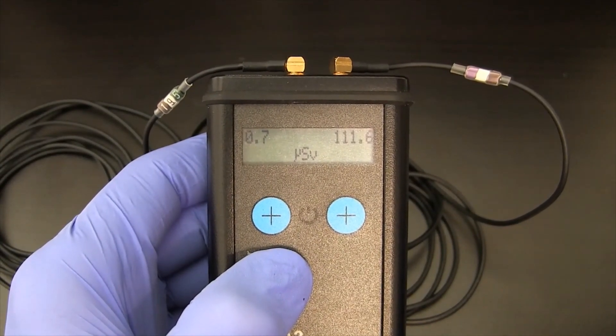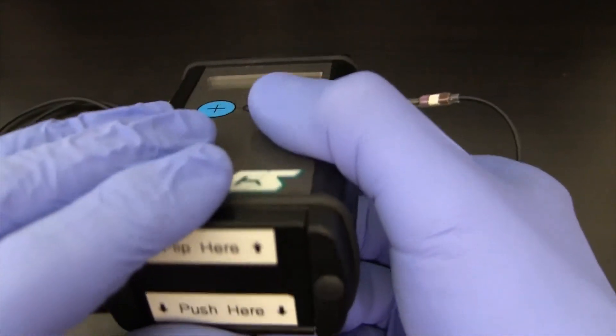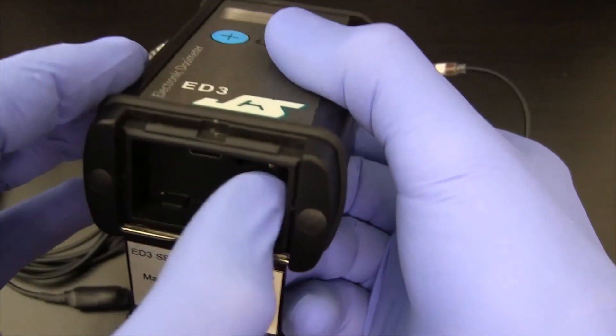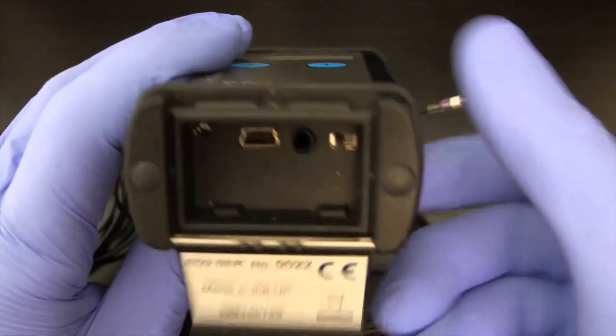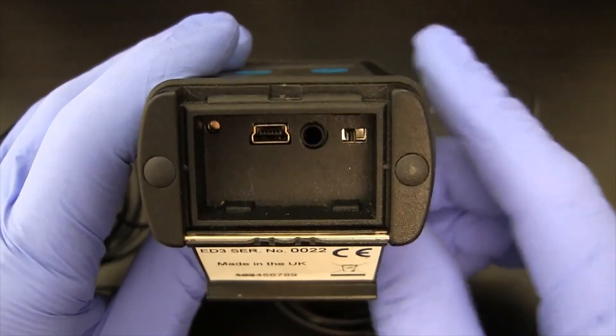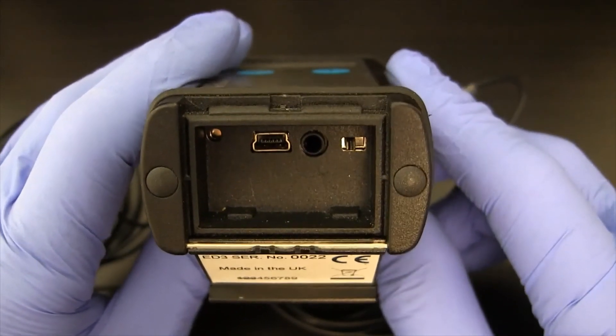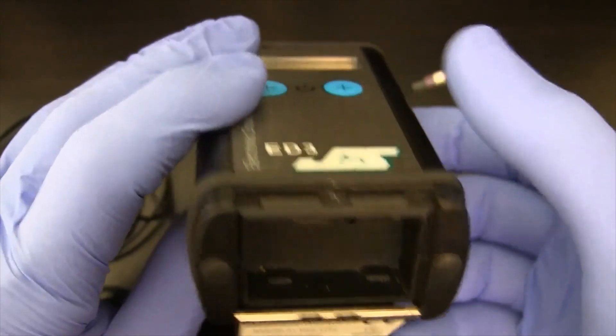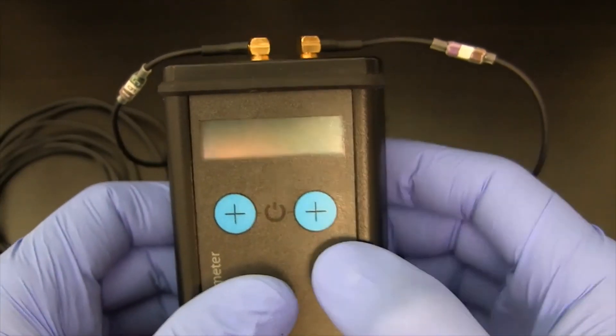Once we're finished with the unit, it's just a reverse process of opening the lid on the bottom and turning off the system. At this point, you could connect a USB cable and then download the data to the PC.